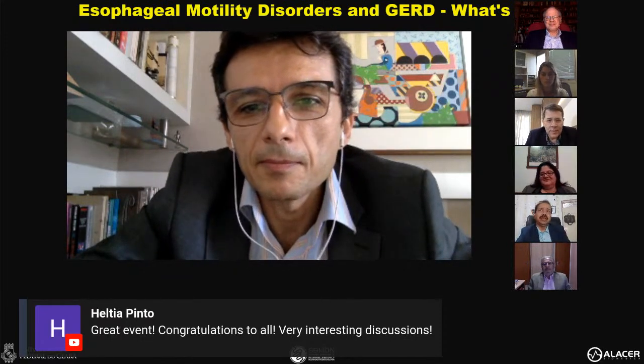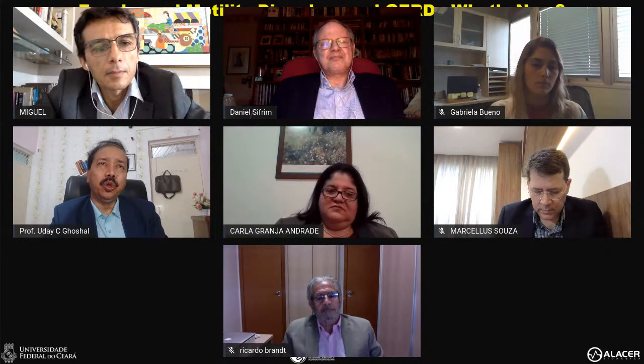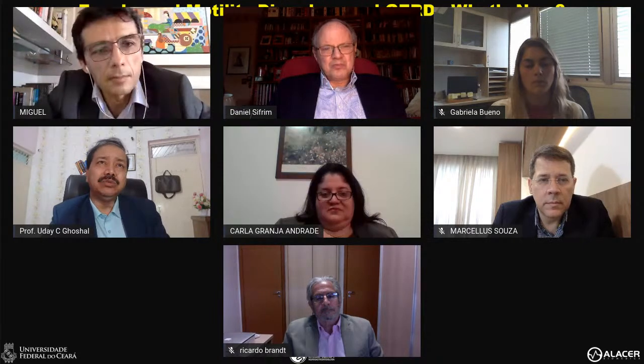Yeah, I have a comment here. I agree with Professor Daniel that this is not a skeletal muscle disease. This is a smooth muscle disease. In the upper esophagus, you had beautiful contractility. If somebody has skeletal muscle disease, you will have different symptoms; it will be more of a transfer dysphagia rather than esophageal dysphagia. This patient probably had esophageal dysphagia. Also, skeletal muscle disease will manifest with many other associations; typically neurological patients have it. Myasthenia gravis can have skeletal muscle disease. There, if you keep taking multiple swallows, the later swallows will have more hypomotility than the earlier swallows, which is typical of myasthenia. So it is smooth muscle disease.